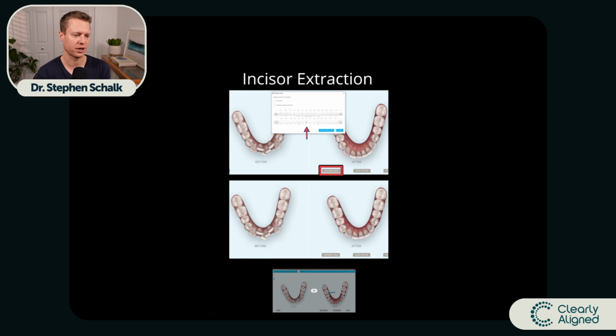So the outcome simulator, this is, again, such a crucial and important tool in your toolkit here, is being able to actually simulate the position of where his teeth would be at the end of treatment. Again, we're just providing information. And if the patient wants to move ahead with treatment, then that's something that they decide to do. But we're not trying to sell them on anything here. He can go ahead and make the decision of whether he thinks this is beneficial or not based on the information that we're giving him.